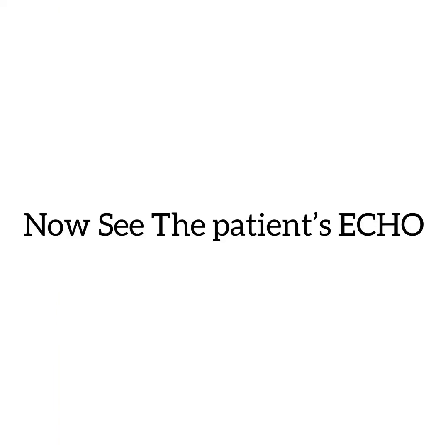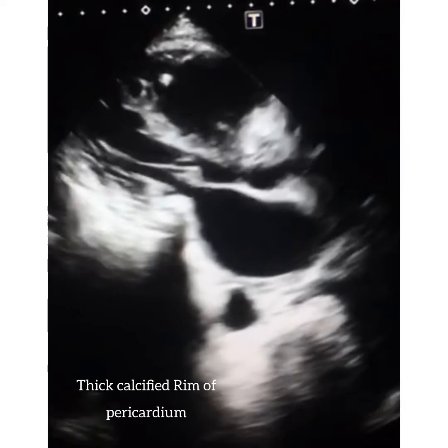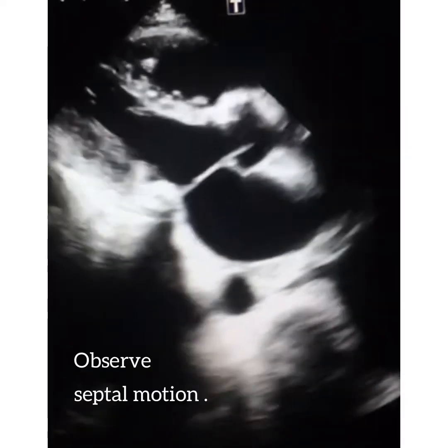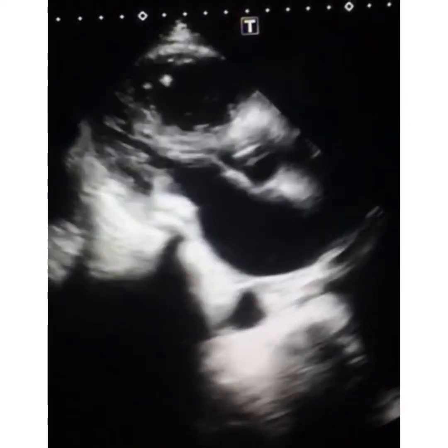Now see the patient's echo. The first is the parasternal long axis view. You can see a thick calcified rim of pericardium. You can see the interventricular septal motion. This is called septal bounce, clearly seen.